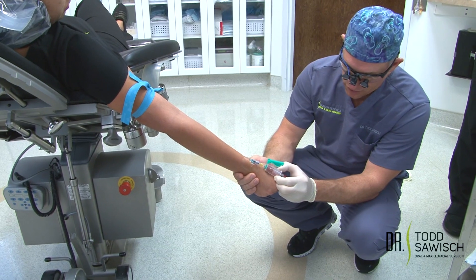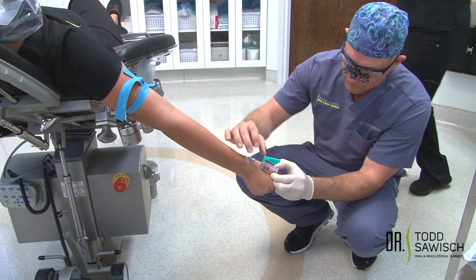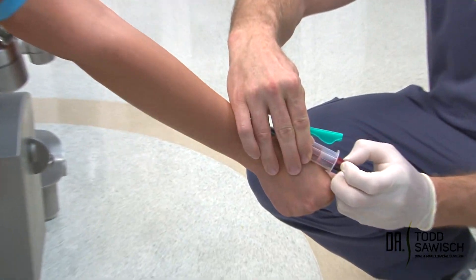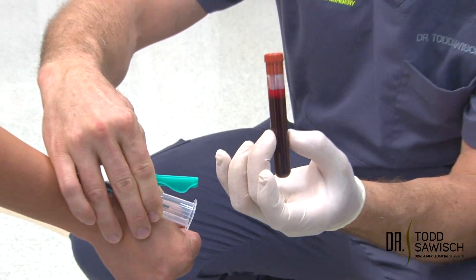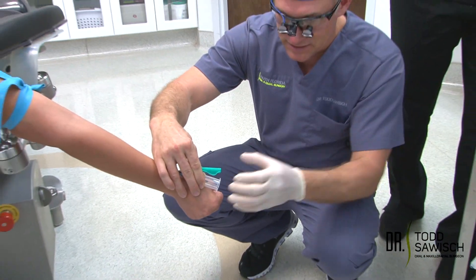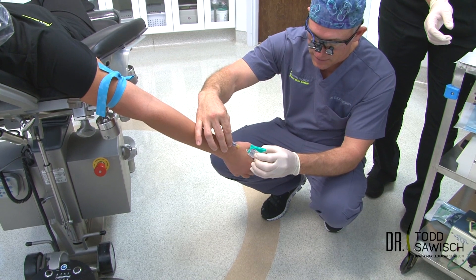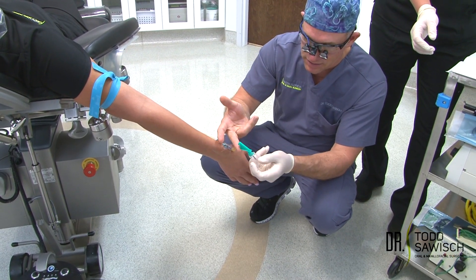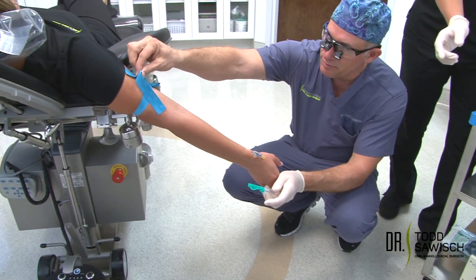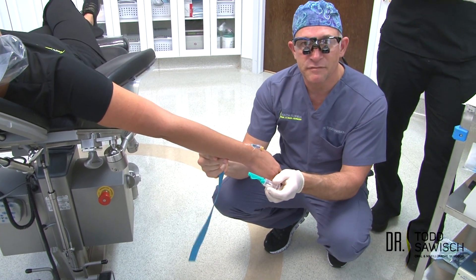Once the tube is full and you have all the blood that you need, support the vacuette and take out the vacutainer tube. You can see that we have blood completely inside of it. Once we're done, the patient's going to open their hand. Remove the vacuette, put the protective cap on so the needle is secure, and then remove the tourniquet from the patient. That's how we draw a PRF.